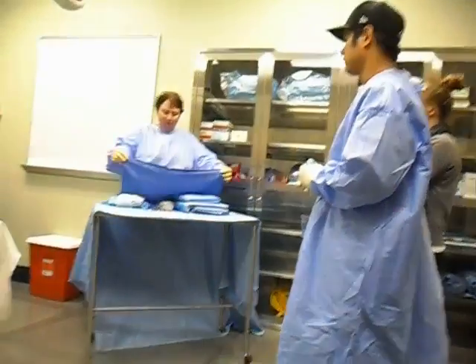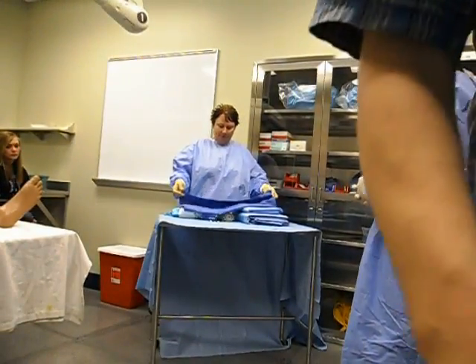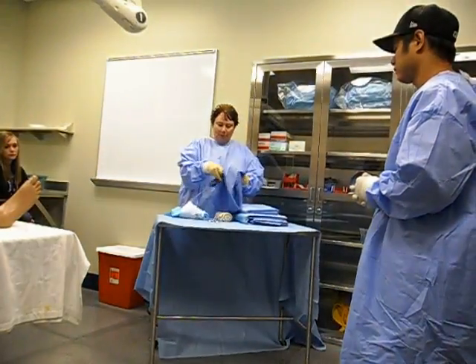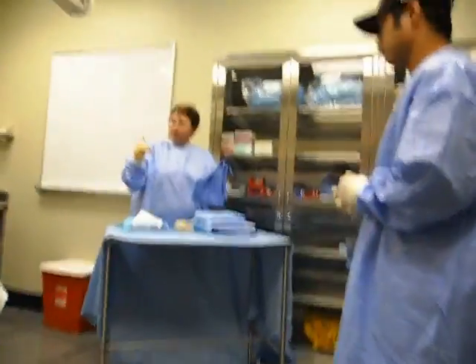The towel you're going to want to put either in half or in thirds. And you're going to need a towel clip — either a perforating or a non-perforating towel clip.